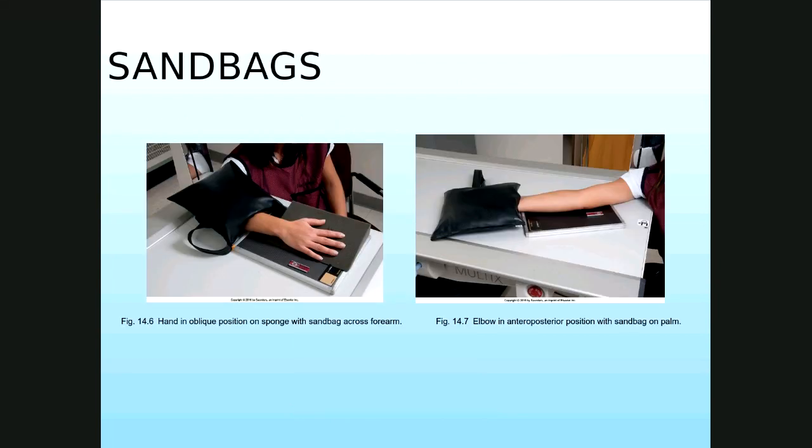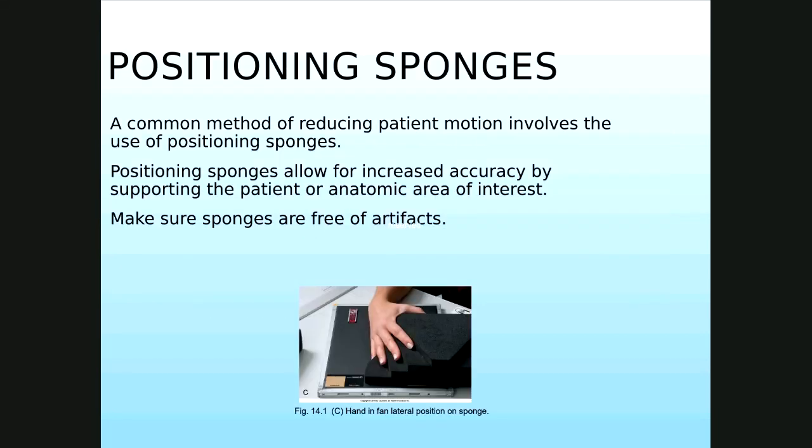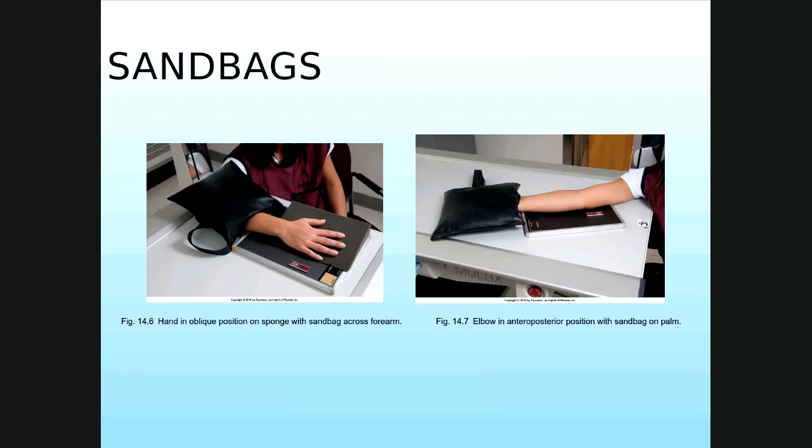So, sandbags. Like those sponges, if I go back for a second, these also are very radiolucent, very lightweight material. The ones that I'm telling you that we have in the department that are green are a little bit thicker, so they're a little more radiopaque than this would have been. Okay, this may leave no artifact on the images whatsoever. But when you get to things that are a little more radiopaque, like the sandbags, sandbags literally are full of sand, and sand is very radiopaque, but they are useful as an immobilization device.